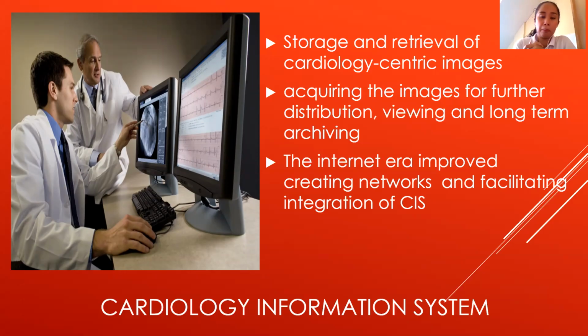The cardiology information system is used for acquiring the images, for further distribution, viewing, and long-term archiving. Through the internet, it improved the creation of networks and facilitated the integration of our cardiology information system.